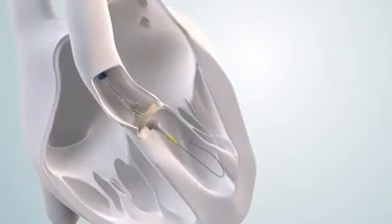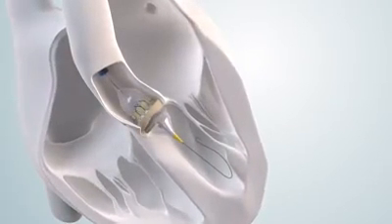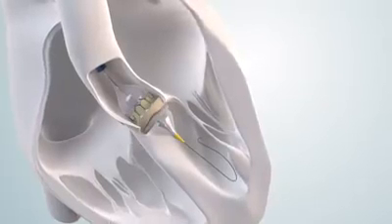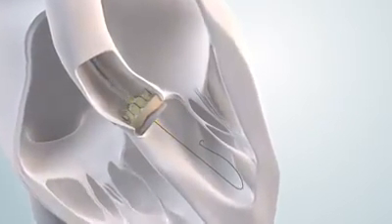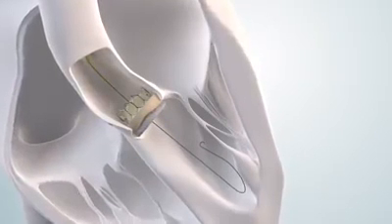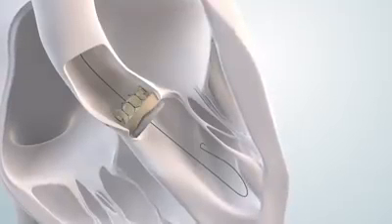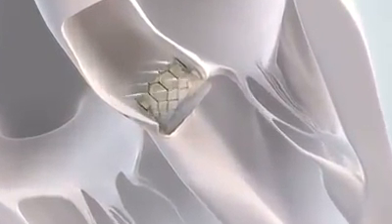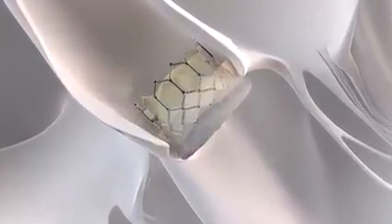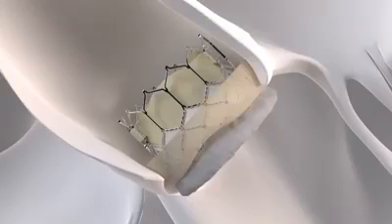The balloon of the delivery catheter is inflated with fluid, expanding the new valve within your diseased valve, pushing the old leaflets aside. The balloon is then deflated and the delivery catheter is removed, leaving your new heart valve in place. The frame of the Edwards SAPIEN 3 transcatheter heart valve is strong and will use the calcified leaflets of your diseased valve to secure it in place.